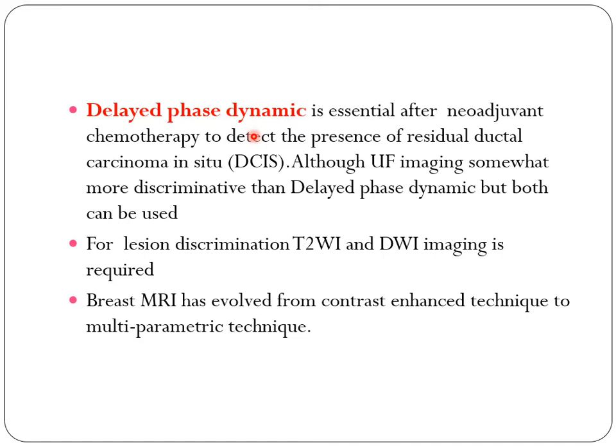Screening MRI means this is an indication for the breast MRI, you know, for some of the screening mammogram. Yes. But can we use MRI for screening? Yes, also. Why? I will talk about it later on in the indications of the breast MRI in the next few slides.